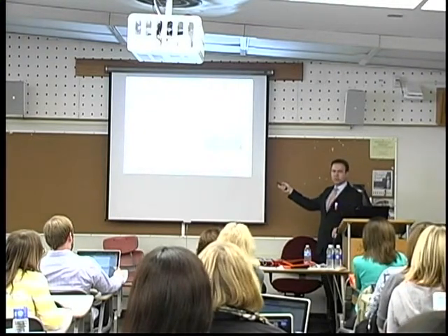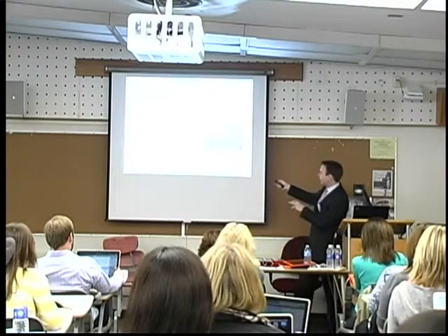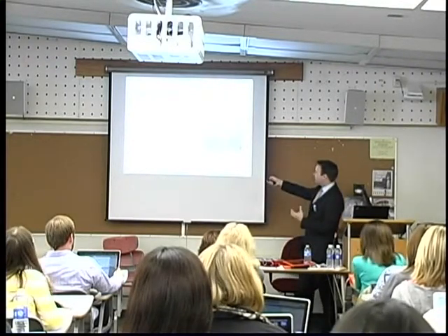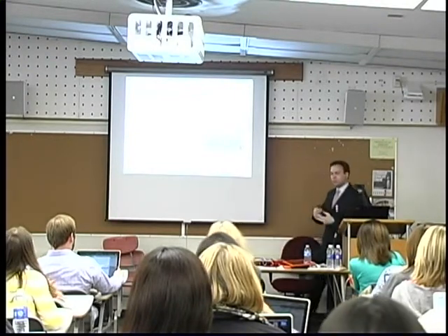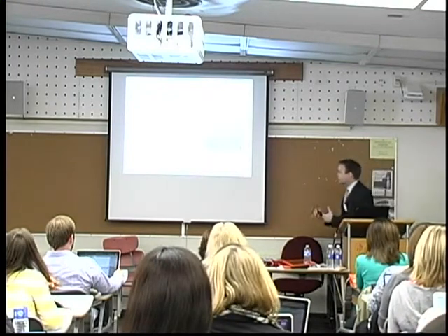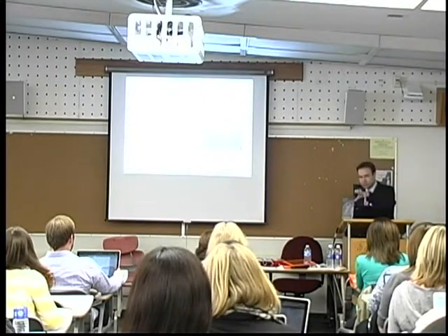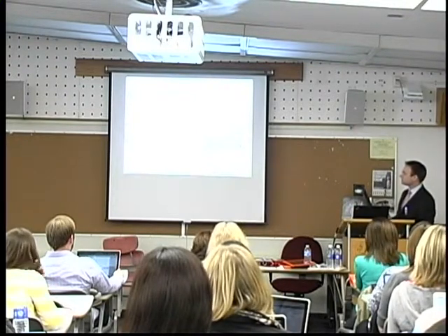So there are particular software solutions where visual scene displays are still there, but you can add some more salient highlighting or circling around it to make the important graphic symbols really stick out and make them more easily recognizable for those individuals, whether they are on the autism spectrum or have another developmental disability, that have these sensory processing difficulties. I would then go down that route if I had those learners where I find that having a visual scene display actually makes sense.